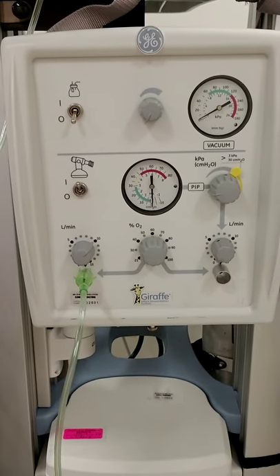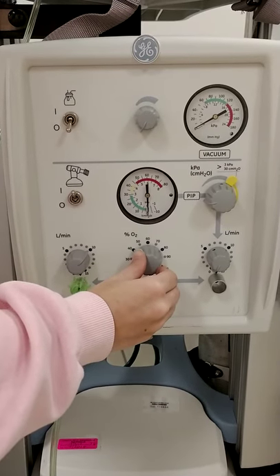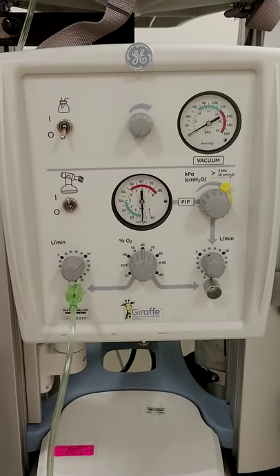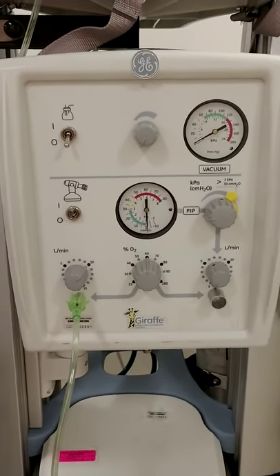The dial in the center is our blender, so you can dial in your FiO2 to wherever you would like. Next we're going to discuss how to set up our T-piece resuscitator.